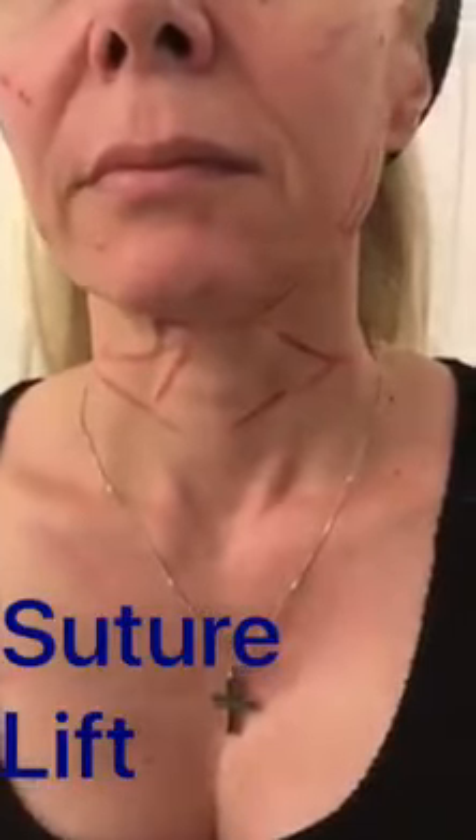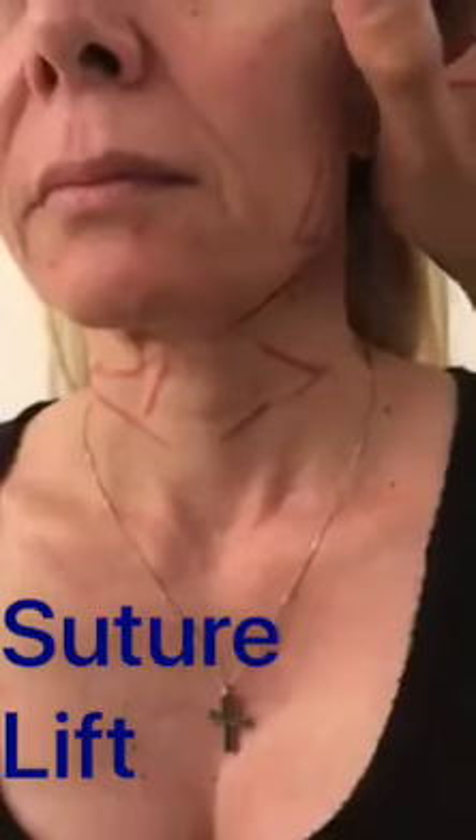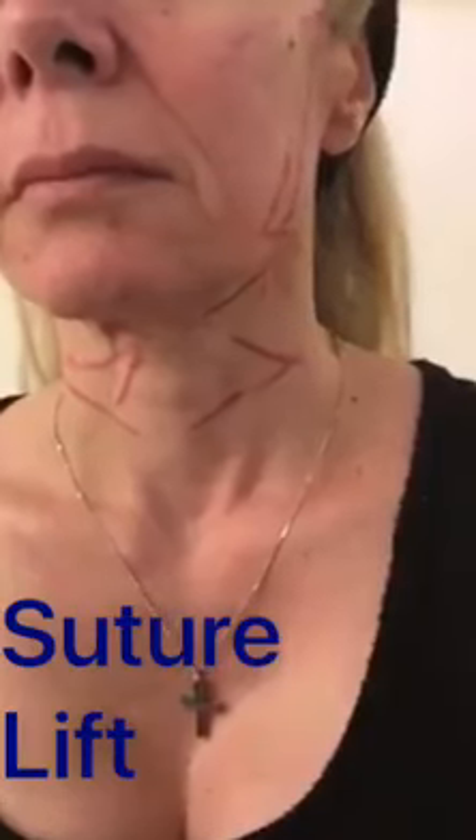Welcome to Cyprus Pressure Surgery. Today we proceed with a thread lifting technique in order to do a lifting of the face. We have a patient that is not interested in invasive cosmetic surgery, so no surgery in this patient.